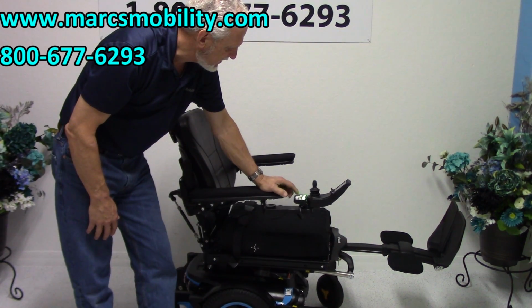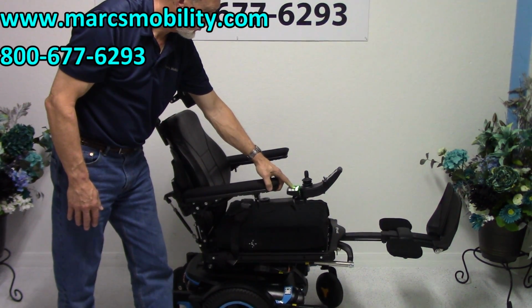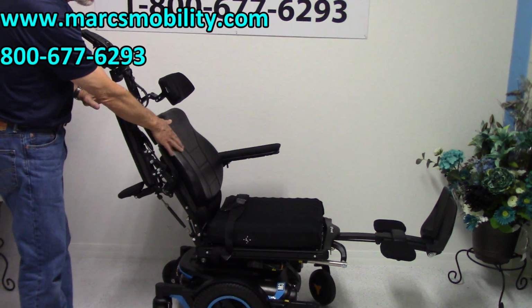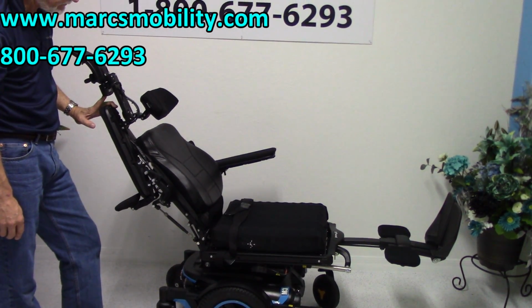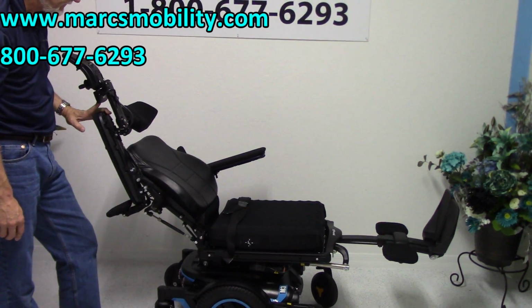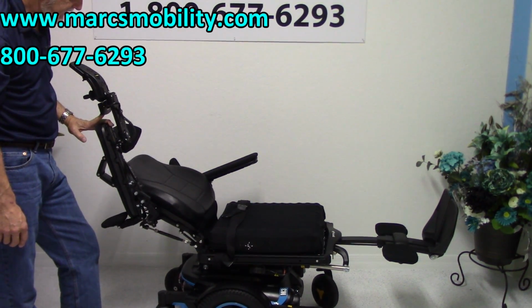And another function that this chair has is called the electric recline. Whoop, hit the wrong button. The electric recline is when the back, right here, goes back by itself. That's called the electric recline. So if you want to take a nap or relax in your chair, we'll see how far down this goes.